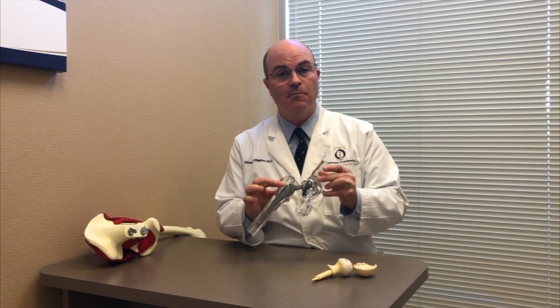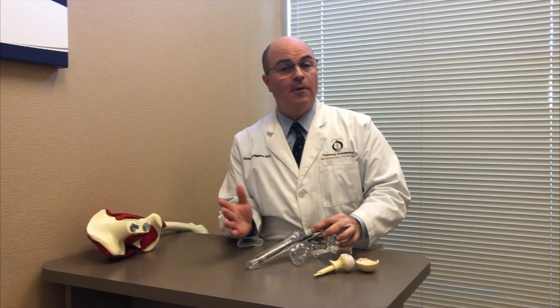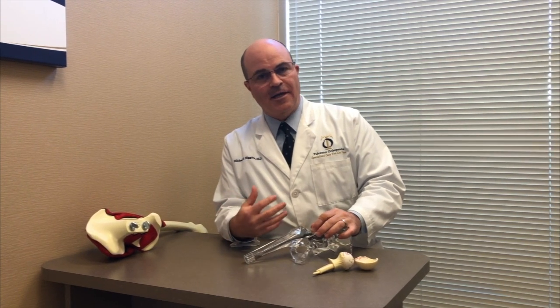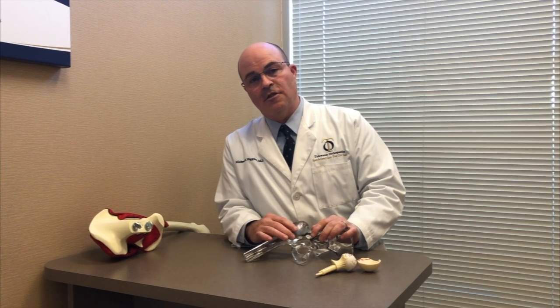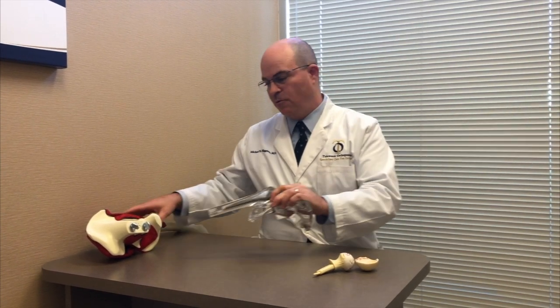Hip replacement surgery has been done for a very long time and it's an excellent surgery — patients do very well with it — but there are different ways of doing it. I do the direct anterior Jiffy hip, which is a muscle-sparing approach. I can do the surgery without cutting any muscles, in comparison to a traditional hip replacement through a posterior approach where muscles are split and cut. Let me show you what the difference is between those two.